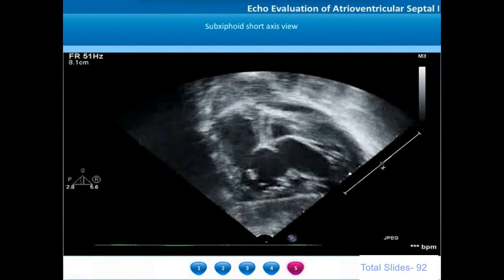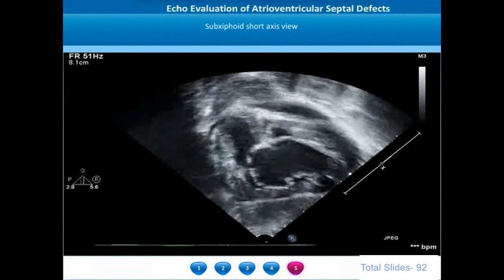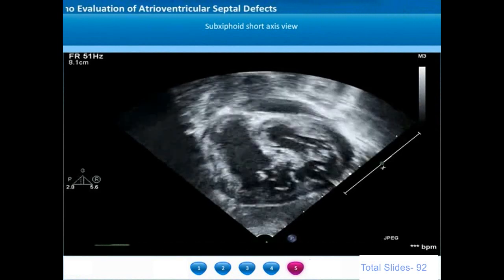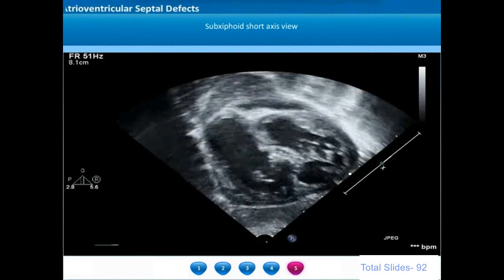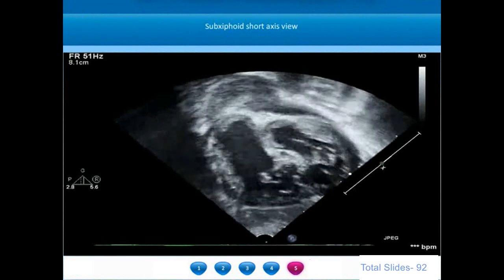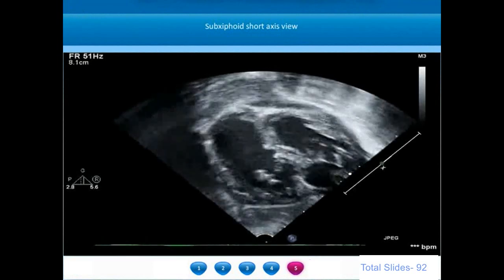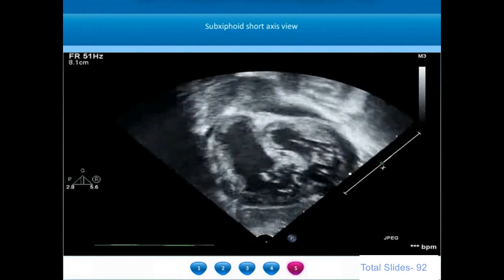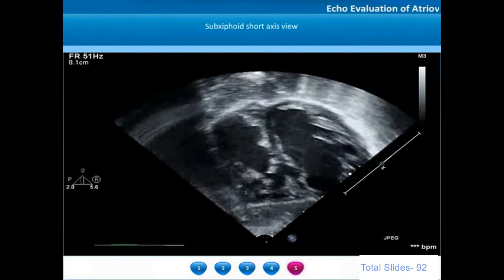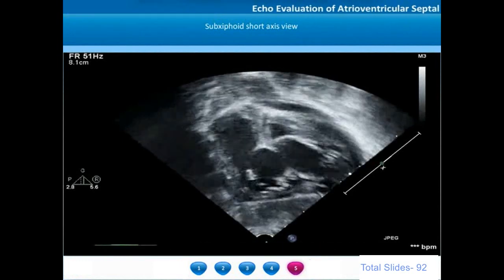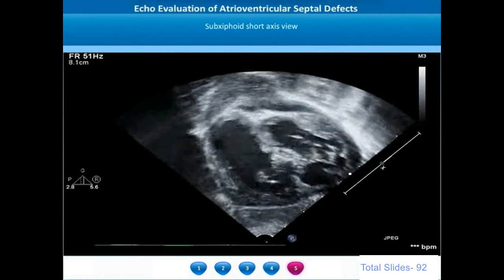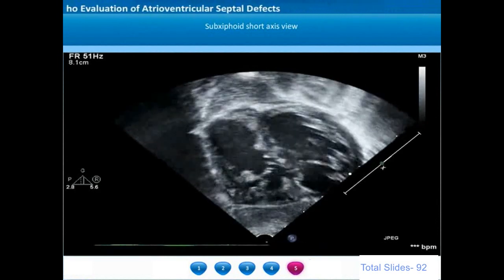On the short axis of the AV valve from the subcostal view, we can notice a common AV valve ring with separate superior and inferior bridging leaflets visualized very well.